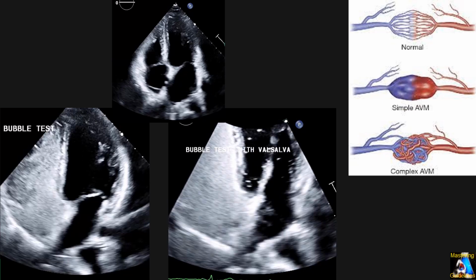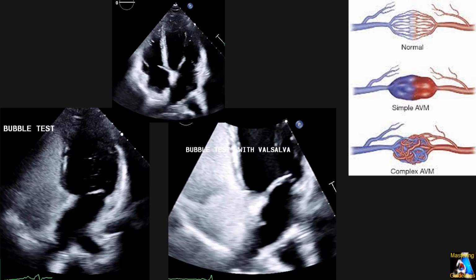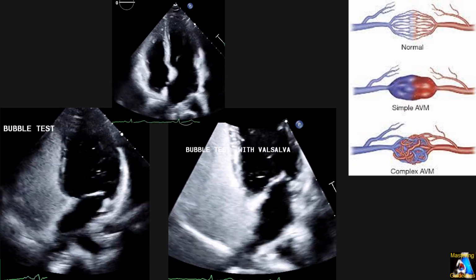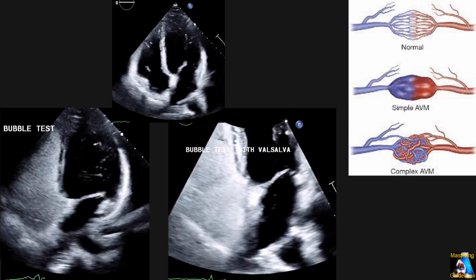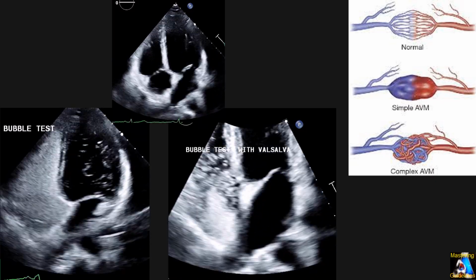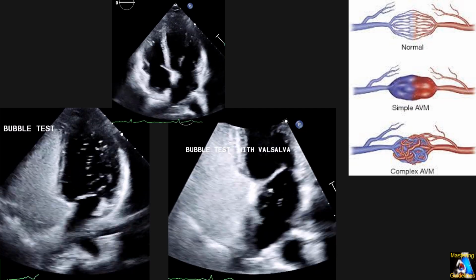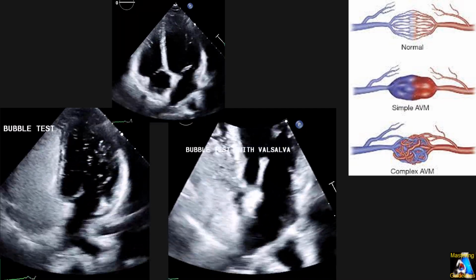As you know, echocardiography is the main study for any patient with shortness of breath, especially when it comes to exertional dyspnea in young and healthy people. In those, the reason for echo is first of all ruling out any significant valvular disorder, LV or RV dysfunction, and those types of cardiomyopathy that, at least at the early stage, have exertional dyspnea.